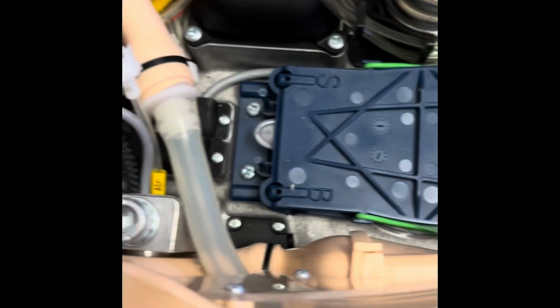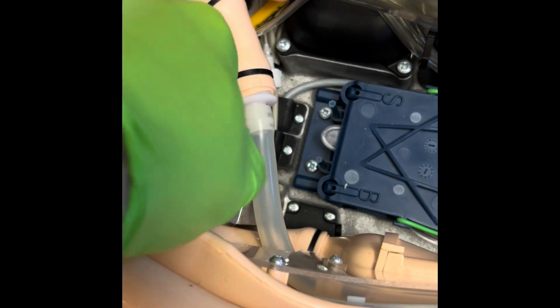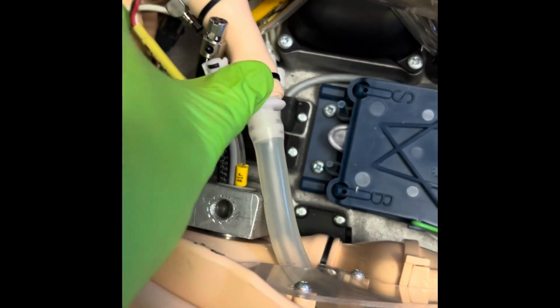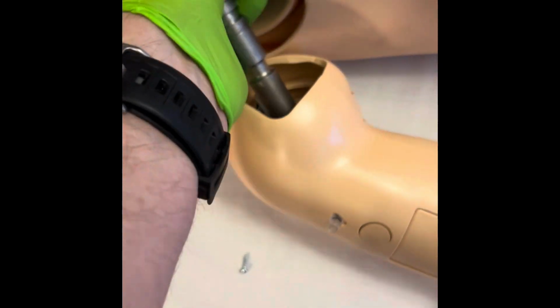So there it is. I've already unhooked mine because I started on this job and I thought, I'll record a video. So I'll go ahead and release this. Just loosen it up and then take it out. Unclip the 3 parts here. 1, 2, 3. I'll have to roll the skin back over and then take the arm right off and guide the wires out of that spot there.